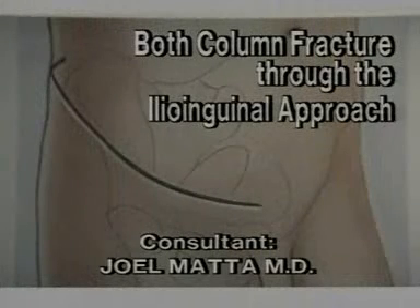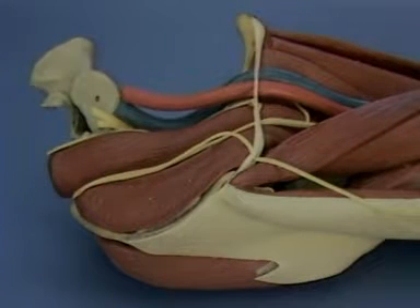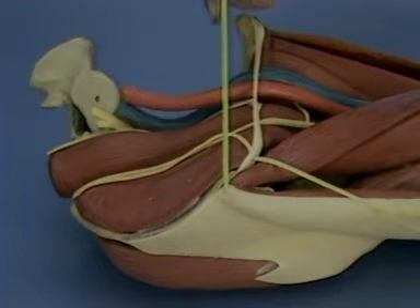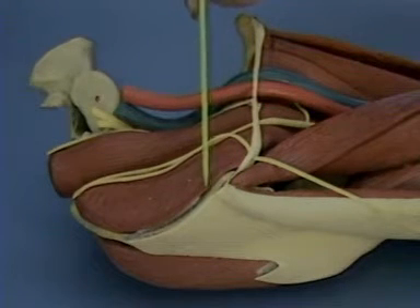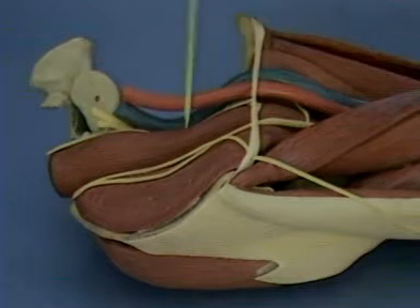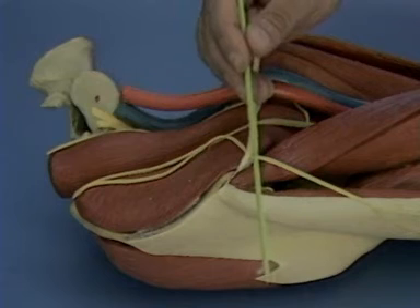Both column fracture operated through the ilioinguinal approach. The patient is positioned supine for the ilioinguinal approach, most often on a fracture table. The head is to the left and the foot is to the right. The surgeon stands lateral to the patient.